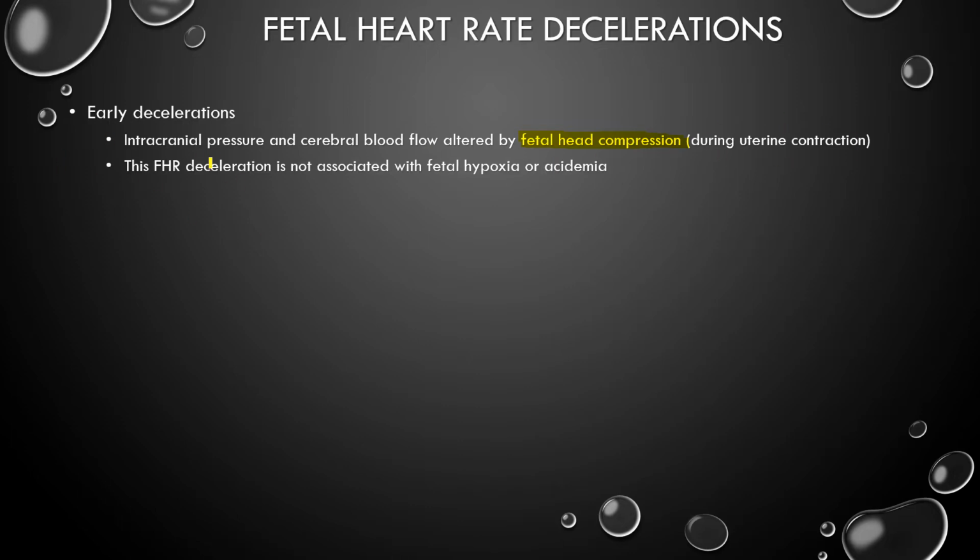So the important thing to know is that this fetal heart rate deceleration is normal, and it's not associated with fetal hypoxia or acidemia. So if you see this on a tracing, you don't have to worry too much about it. It's a very common association with uterine contraction.